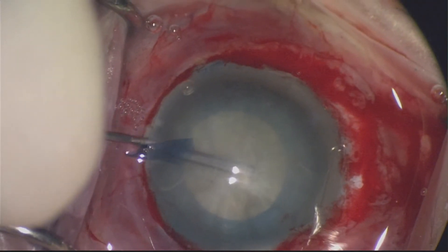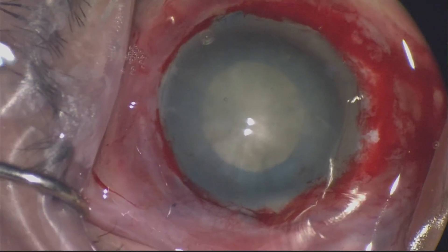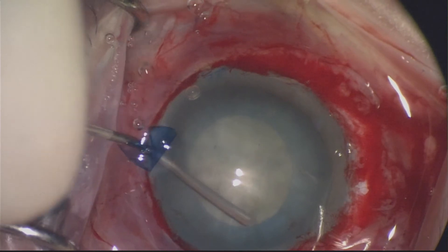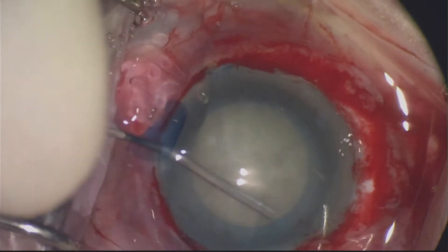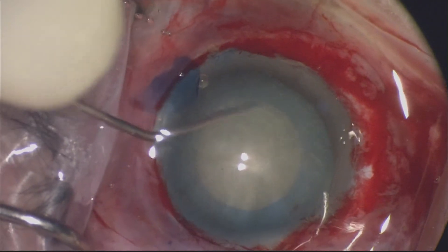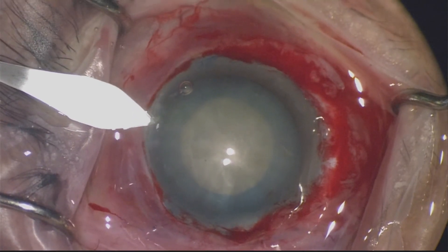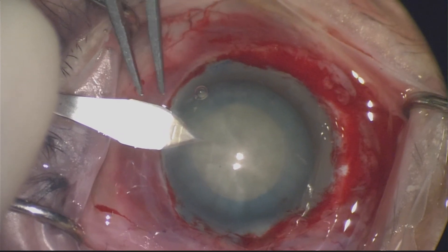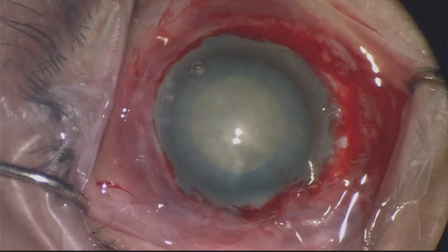The next step is hydrodissection, and again you want to be extremely careful. I'm very gentle with hydrodissection in patients like this, especially with white cataracts. I do gentle hydrodissection while simultaneously pushing the posterior wound down to release some of the viscoelastic. Once I've done the hydrodissection and checked the feel of the lens and whether it's slightly rotating, I complete the wound.